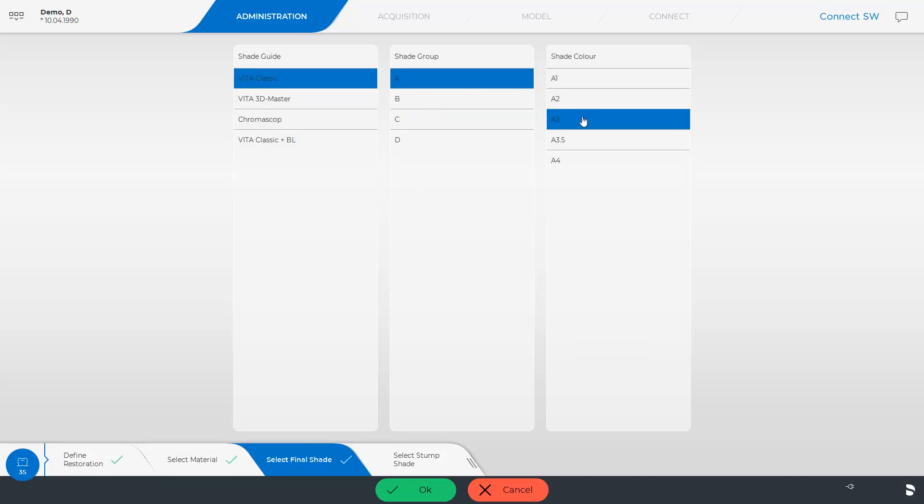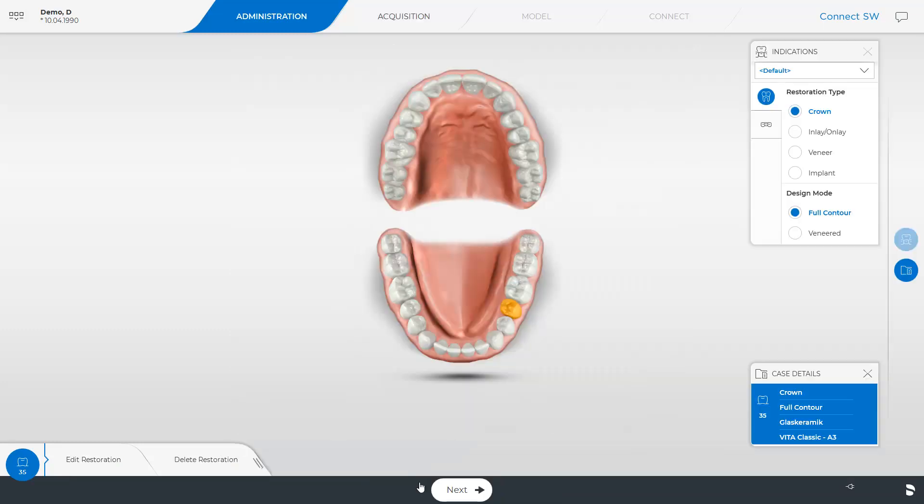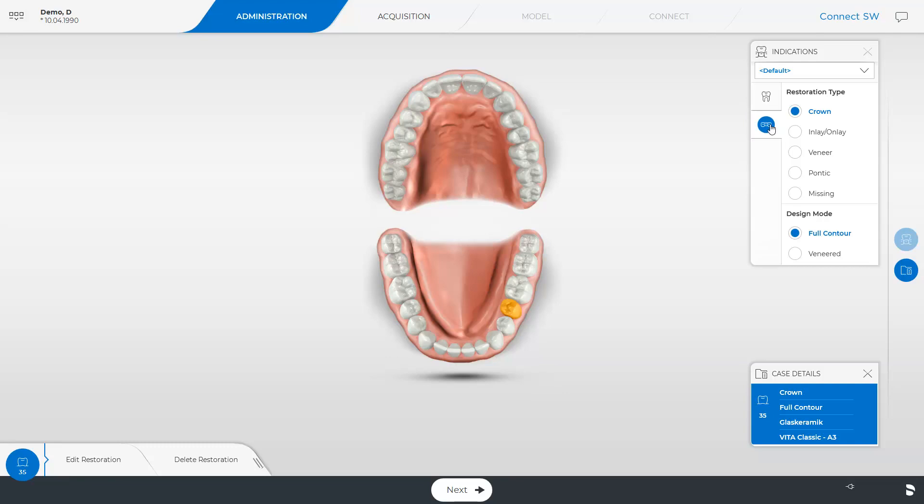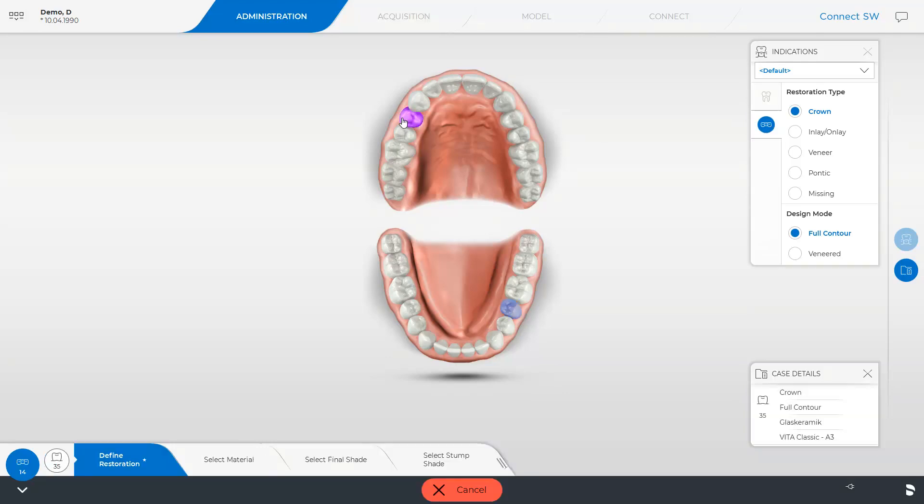We end our selection at this point and confirm with OK. For demonstration purposes only, we will create a bridge restoration in the upper jaw. To do this, we first of all select the bridge abutment and then the pontic.